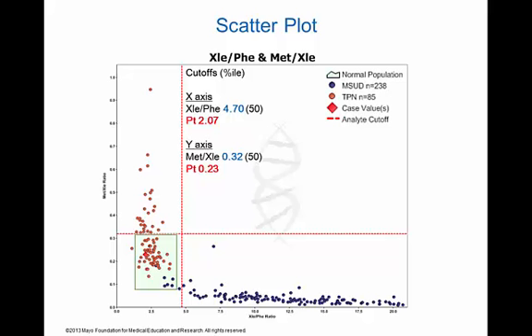Considering the position of this case and the cluster of TPN cases, the separation between MSUD and TPN cases is virtually complete, and this case could be closed with confidence as a nutritional artifact that does not require a referral to follow-up and the collection of a repeat specimen and/or additional laboratory investigations.